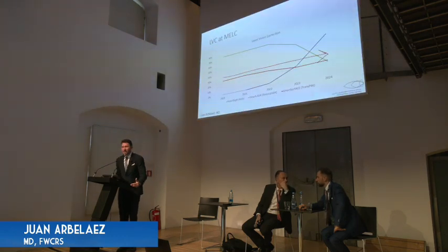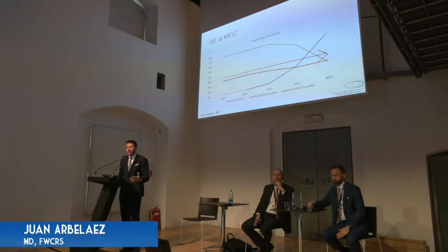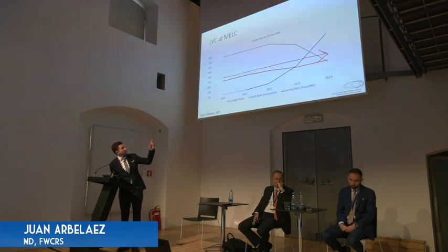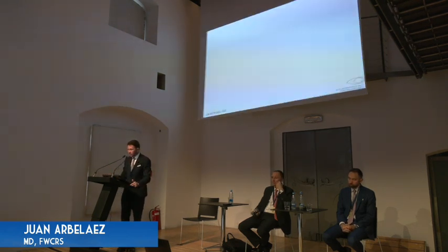So, as I say, this has not changed the performance of our clinic. Now in red, we see all the surface treatments that we were doing in these cases of keratoconus suspect since 2020, and it has been consistent. So the MS-39 has not made any major changes on excluding more patients for femtoLASIK or lenticule extraction. In femtoLASIK, we see in green, we have a big drop in femtoLASIK cases that is being now compensated by the lenticule extraction because we are mainly doing the treatments now with lenticule extraction.